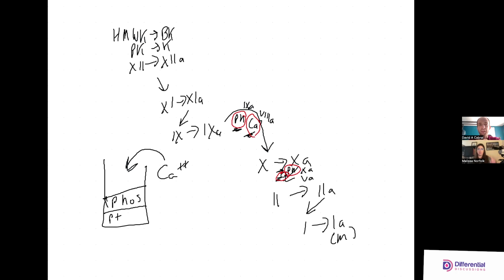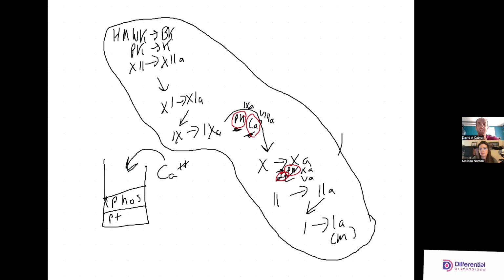I'll say we have different methodologies. We won't know if it's a stable clot, because as soon as clot formation happens, it'll stop measuring. I only drew through fibrin monomers because with our routine tests, it stops as soon as the clot forms. So we never see the activity of activated factor 13. I didn't draw that one in here because these are all the factors that will impact the APTT. I used the term stabilized clot incorrectly, that was definitely a misspeaking on my part. A deficiency in factor 13 is never going to be evident in either the APTT or the PT. So that's an important distinction. We will have clot formation.